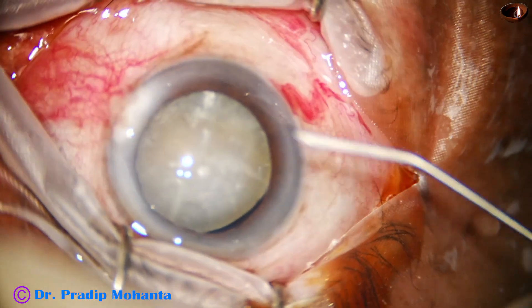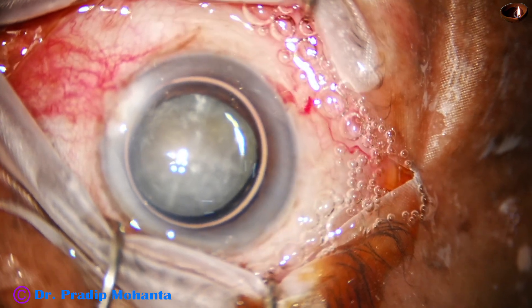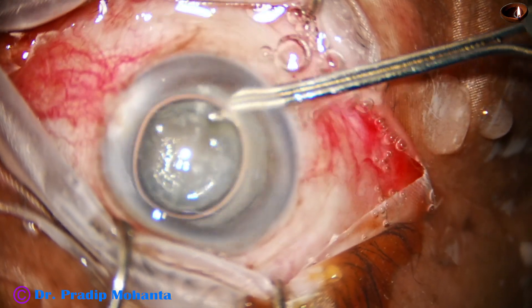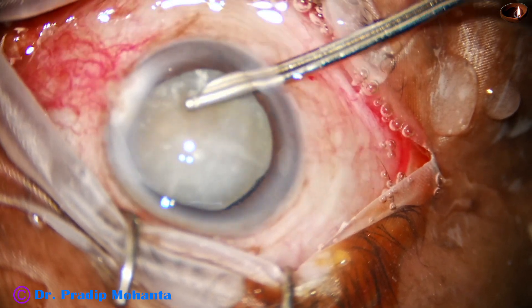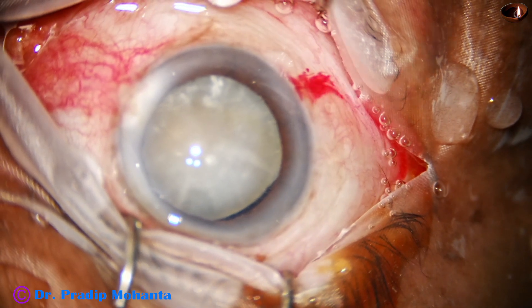First, I make an incision of about 1.8 mm at around 7 o'clock. And now I inject some triamcinolone acetate to see if there is any vitreous prolapse. There is no vitreous prolapse.